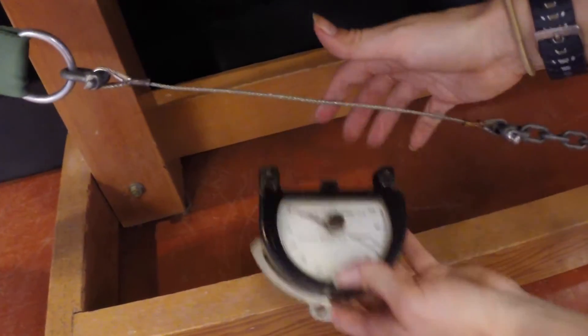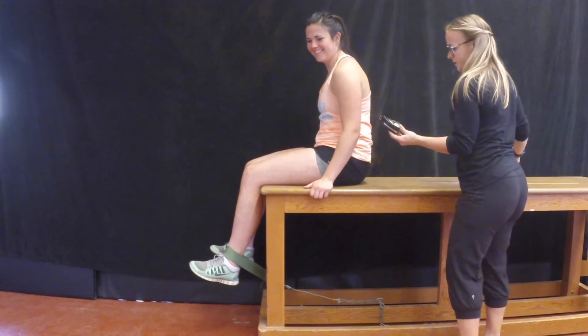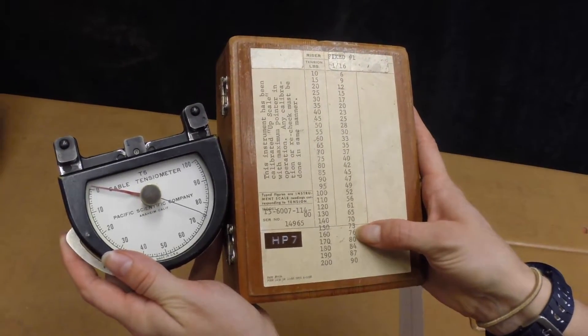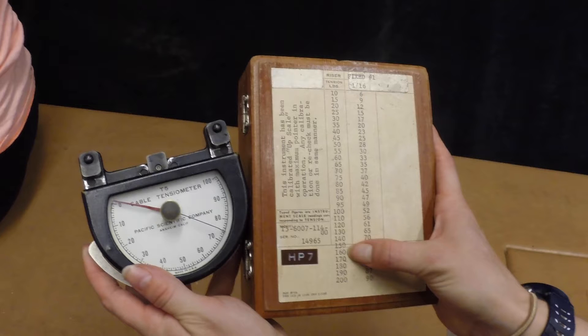This specific cable tensiometer is unitless, so compare it to the table on the box to determine your client's results. In this case, the client achieved a 76 which is equivalent to 160 pounds.